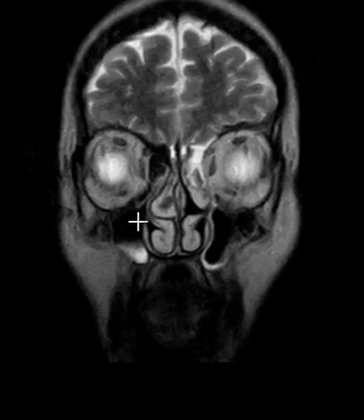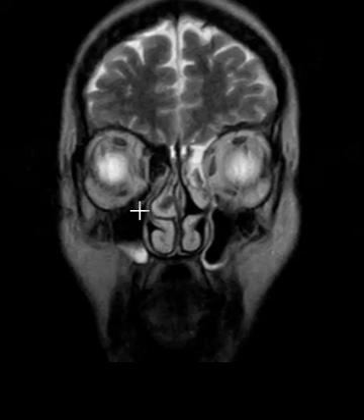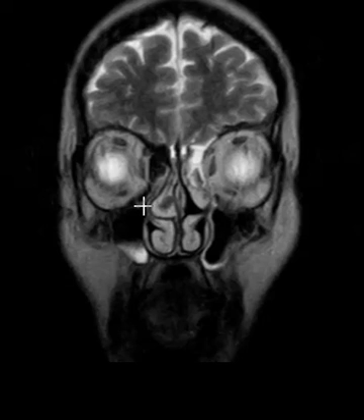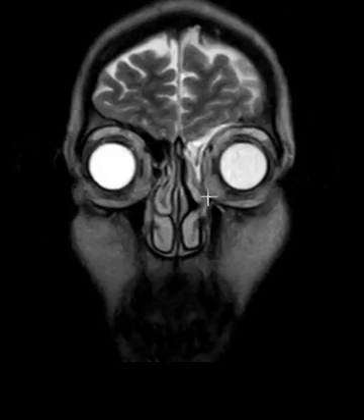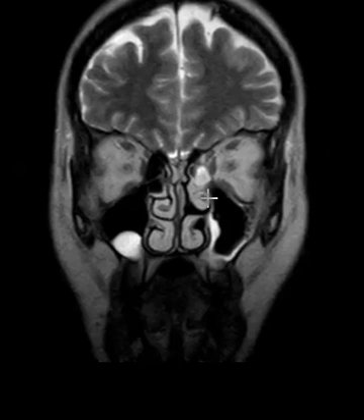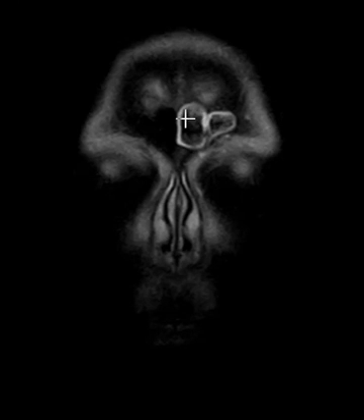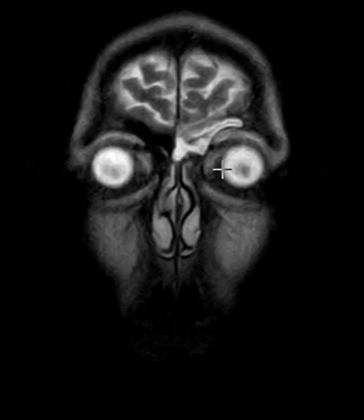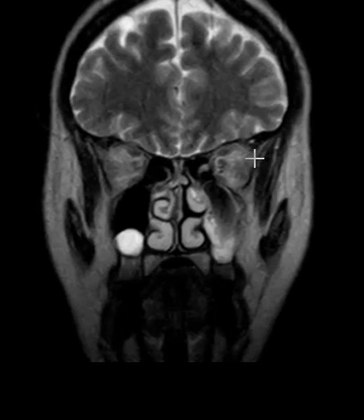When occluded, this contributes to headaches. On the right side you can see a little dark band — the right ostiomeatal complex looks open with air-filled communication, while the left one is occluded. So this is an example of a normal brain thankfully, but left sinus inflammation and sinusitis with that fluid level, and the frontal sinus is involved which is worrisome. We're going to get them to an ENT as soon as possible for treatment. Thank you very much.